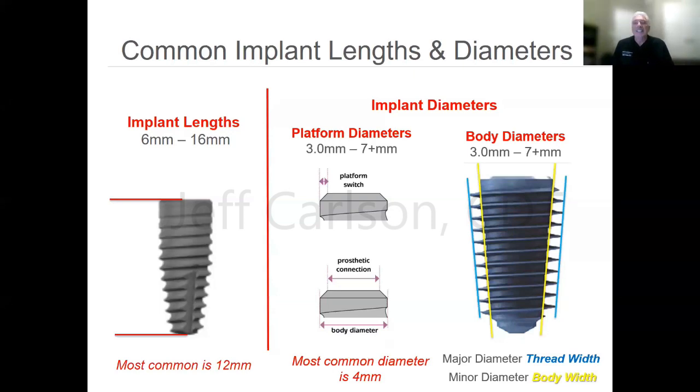When we're doing cases where we're looking to undersize implants, these immediate load type of cases, be it crown and bridge or the full arch immediate load, or even simple locators when we want to be able to load immediately, if you're in soft bone and you're undersizing the osteotomy, it's important to know that the minor diameter is a solid object going into the bone. You may have to open up your implant osteotomy to at least this minor diameter to allow these threads to pass through and then engage.